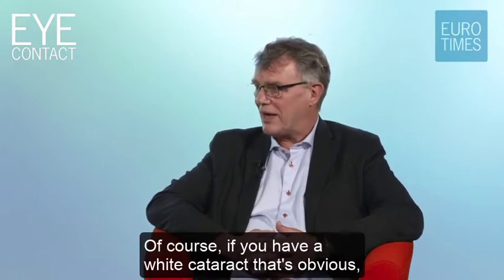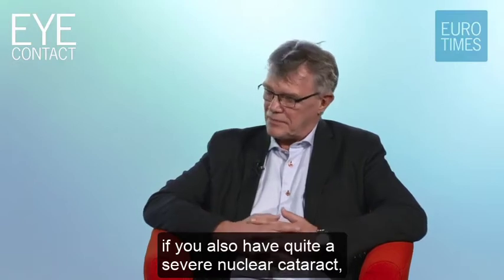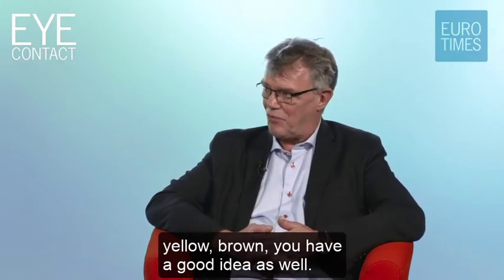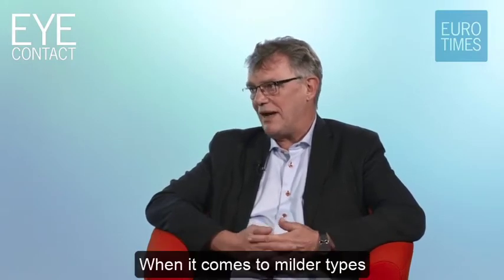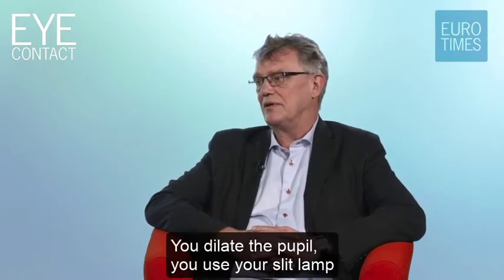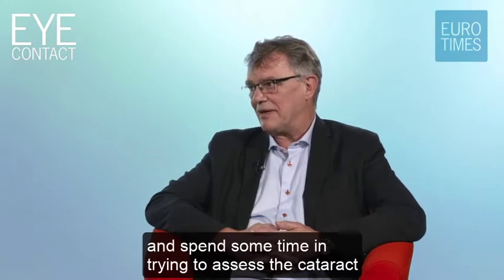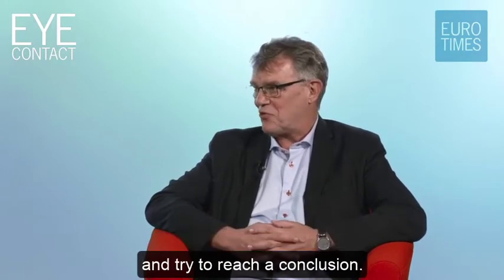Of course, if you have a white cataract, that's obvious. If you also have a quite severe nuclear cataract, yellow, brown, you have a good idea as well. When it comes to milder types of cataract, it can be difficult. Usually you dilate the pupil, you use your slit lamp and spend some time trying to assess the cataract and try to reach a conclusion.